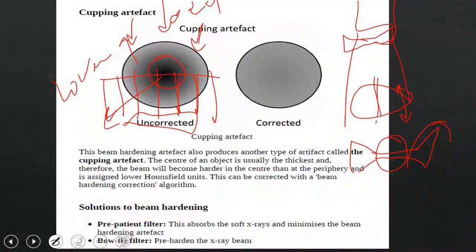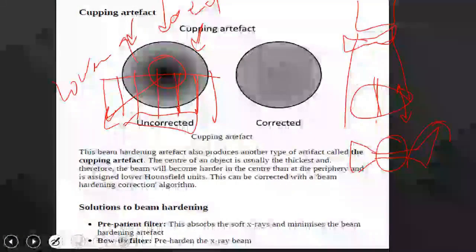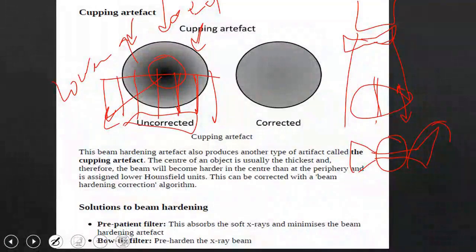It has data stored directly on its own internal system, the detector itself, and begins making automatic corrections based upon incoming information received later. In summary, the role of the biomedical engineer is to perform this calibration at the beginning of the machine's operation. If there is a problem with the image quality, or parts appearing in a certain way, they start performing water calibration or water phantom calibration to correct the readings received by the detector.